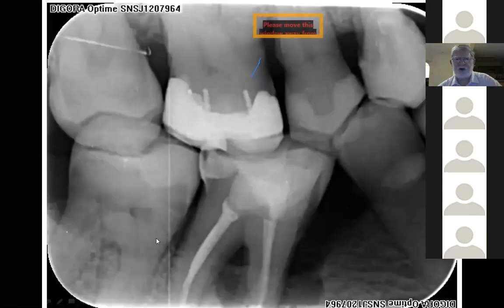Okay, right. So I'll just talk to you about this sort of area first up. Patient comes in, and I've seen this in clinic. I've seen this with the students. Patient comes in, look, I'm having problems chewing. You look in the mouth.